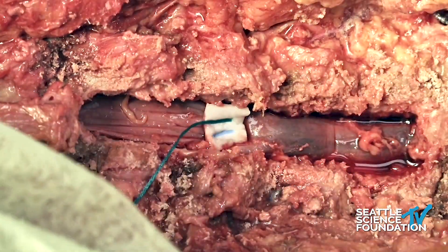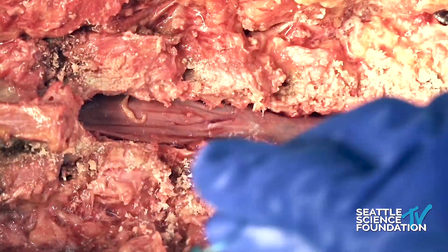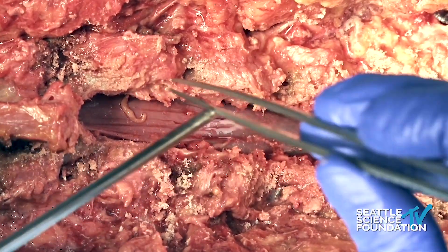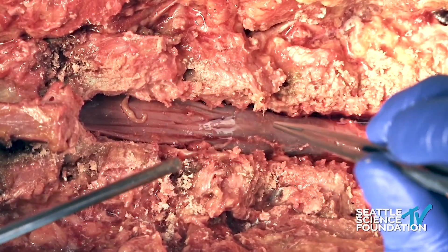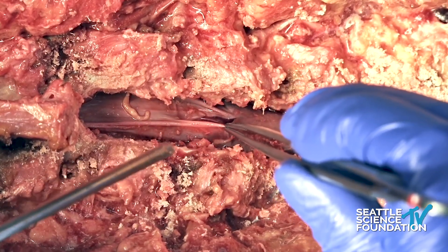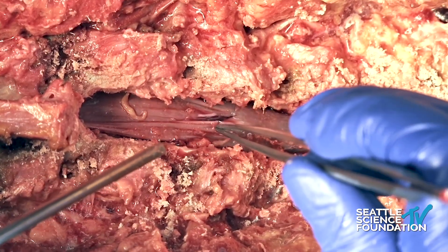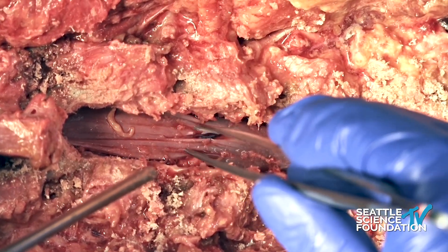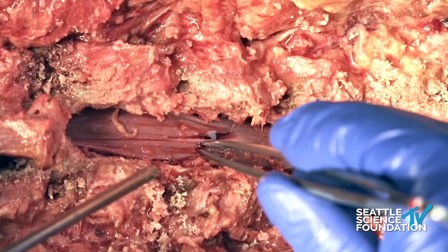So I can continue to expand and make sure I have the margin of the entirety of the durotomy. The second thing is consideration for how we are going to repair this. The repair can either be primary, and in this case with a linear durotomy like this we can certainly repair this primarily with a suture line. We'll discuss some of the strategies later on today of how we would go about doing that.